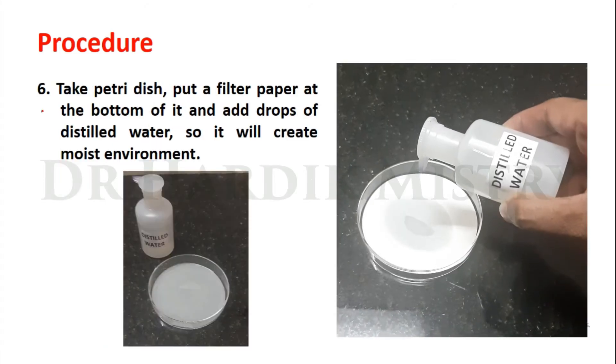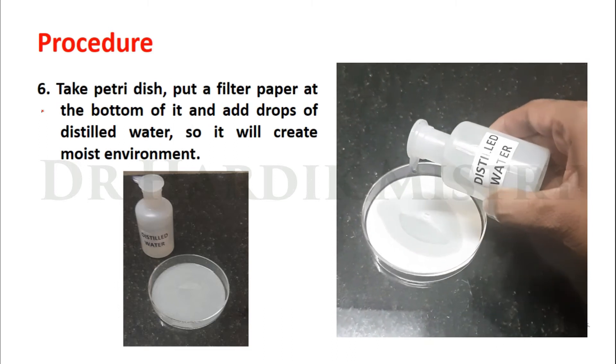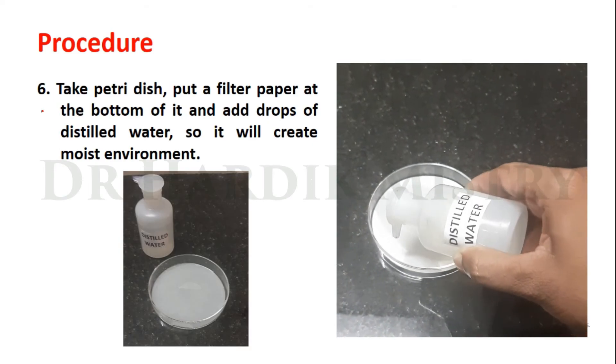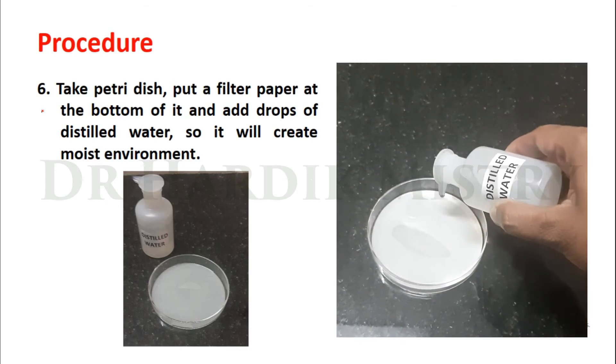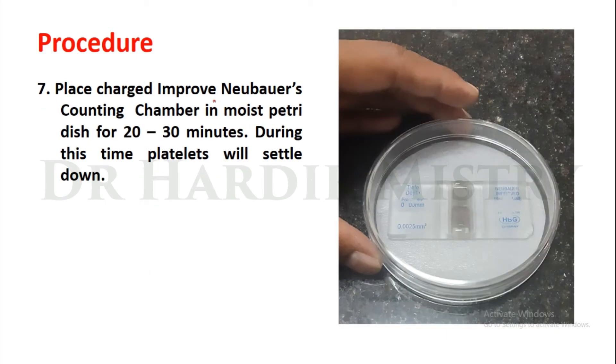Take a petri dish, put a filter paper at the bottom of it and add drops of distilled water so it will create a moist environment. Place the charged improved Neubauer counting chamber in the moist petri dish — there is a wet filter paper to maintain the moist environment.